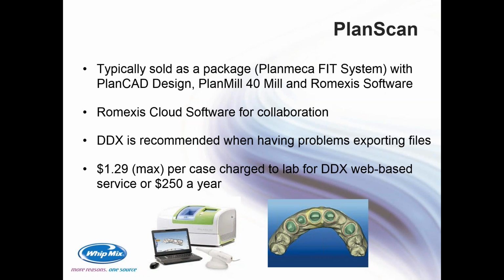If the doc does not get Romexis, then you can use DDX. There have been problems with exporting STL files out of their Planscan, and so E4D will recommend a subscription to DDX, which on the lab side is $1.29 max per case, charged to the lab, or they offer an annual web-based service, which is $250 a year on the lab side. And then Planscan is powder-free, and it is an open system.